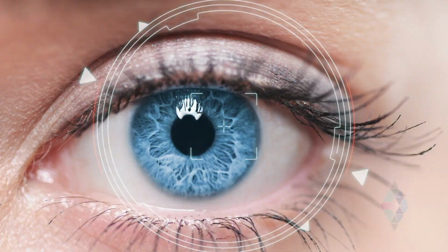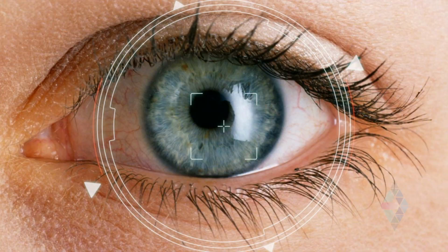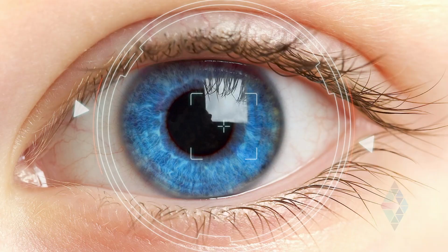Taking that implant technology, they said, well, what about designing an implant for highly nearsighted people? Because the limitation with LASIK in high nearsightedness was how flat the cornea would end up. Remember, we flatten the cornea for LASIK correction for nearsightedness. But in super high corrections, it becomes very flat, like this tabletop, and it can cause some visual aberrations, some visual symptoms. So we can avoid the cornea by putting a very high-powered corrective implant inside the eye.